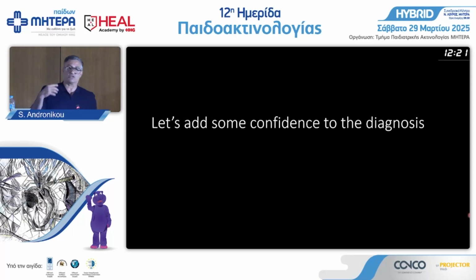So I want to give you some scenarios to add confidence. You want to improve the way you make a diagnosis on the chest X-ray, and there are 3 things I can tell you before I tell you to go to MRI and CT, okay? And let's be honest about it. If you have a population like South Africa where more than 2/3 of the population have tuberculosis or something crazy, and you've got 60 million people, you're never going to do MRI and CT on everybody.